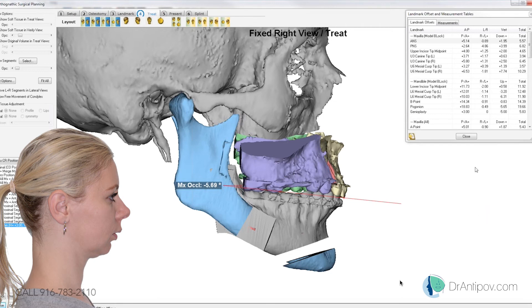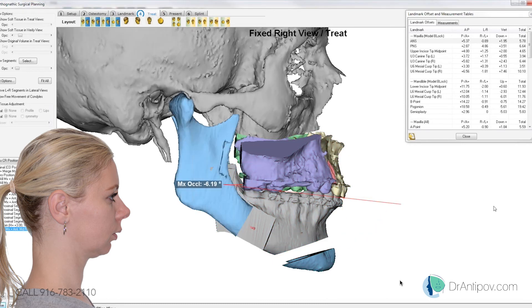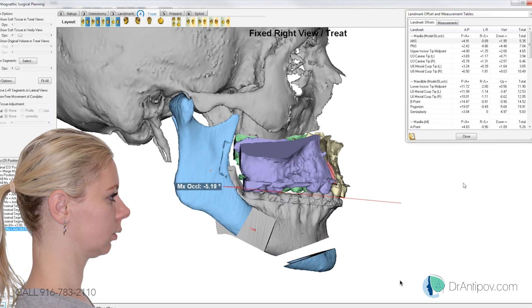Let's also drop that little point down at the back so the whole mandible is just longer without that little step there. Just so it lines up with the lower jaw — yes, look straight. Drop it straight down 5 millimeters and forward 3. What is the Pogonion advancement now? Pogonion advancement is now 18.8 millimeters.